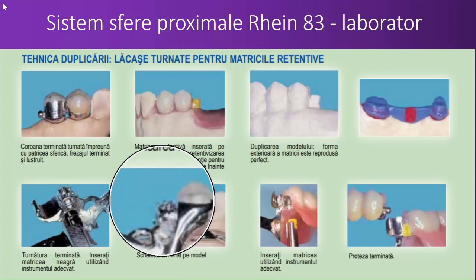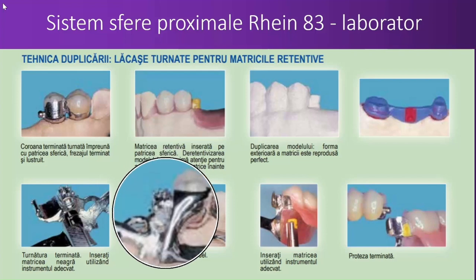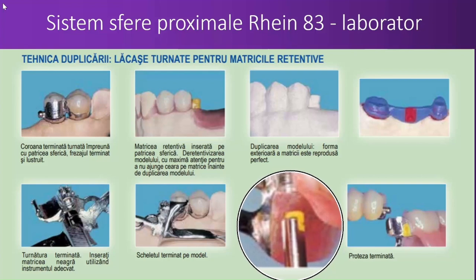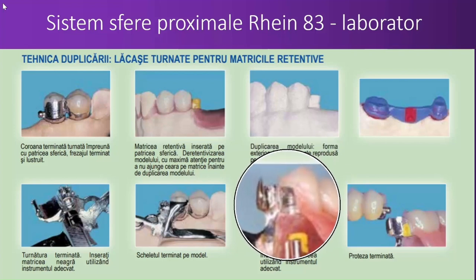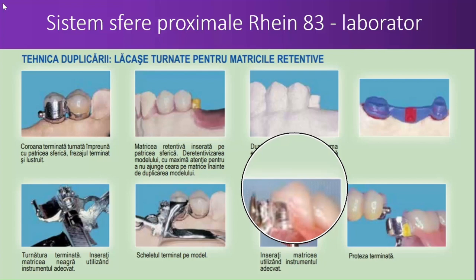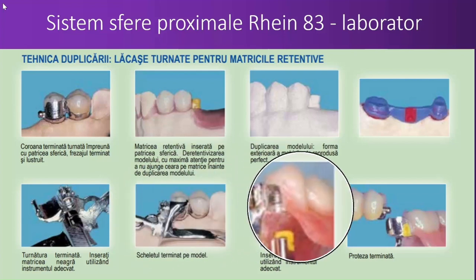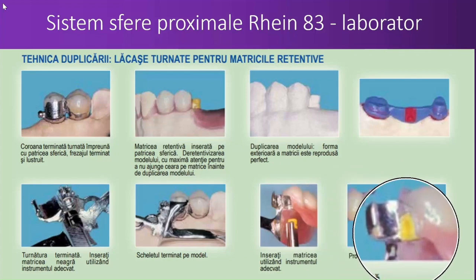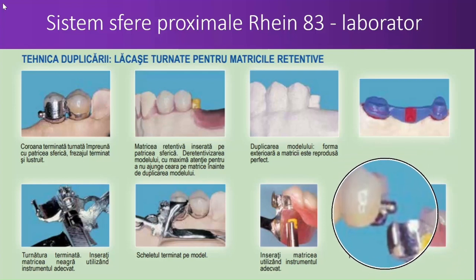Yeah, that's how it is. This is how it looks from the lingual side. You see now the retentive element, plastic retentive element, is introduced in the proper place, that is hidden in the first tooth of the denture. You see now this is covered with acrylic resin, and that's the fixed component, that's the mobile component, and combined denture. Combined means fixed and removable. Equatorial retention on the sphere.